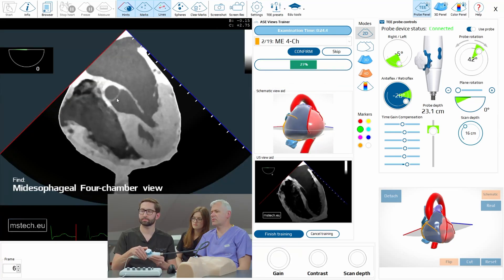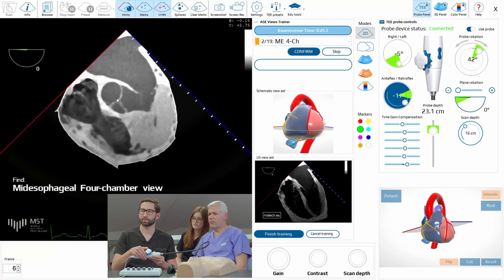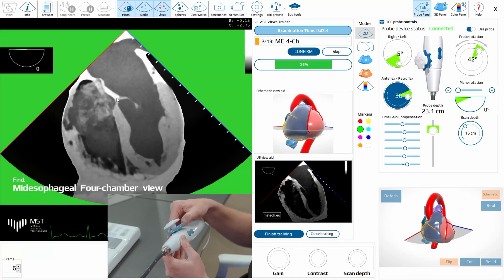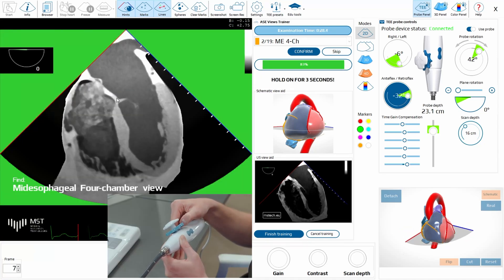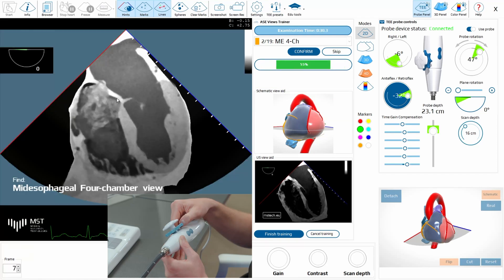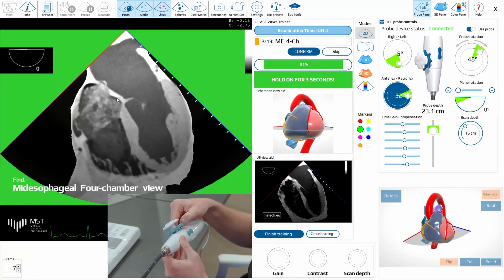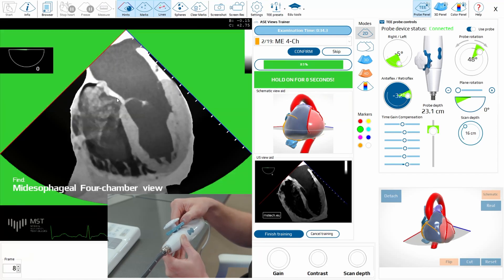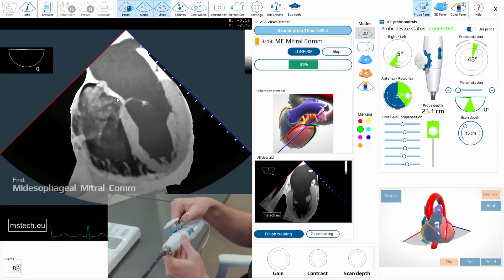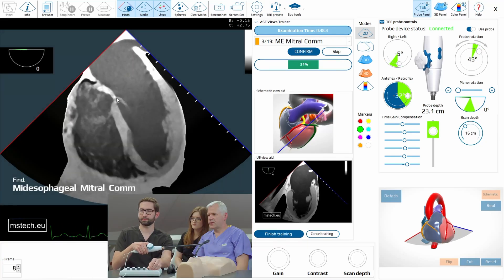Now four-chamber. Very good. Now the next should be the intercommissural, so try to do that.